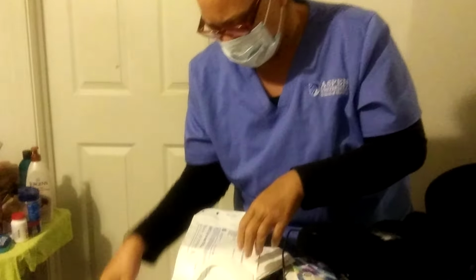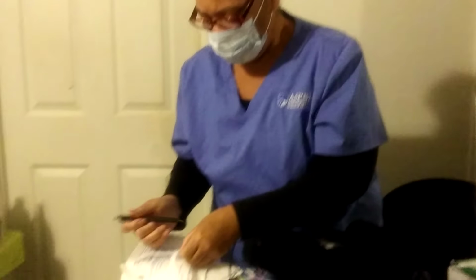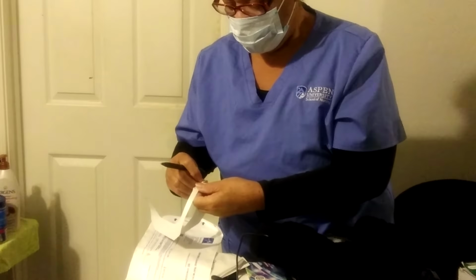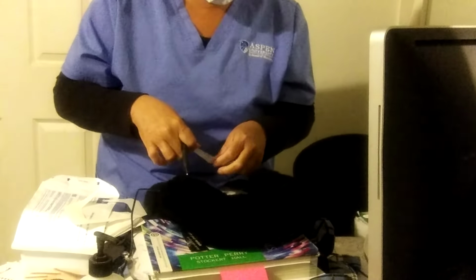And I write down my name, my initials, the date and time I changed the dressing, on a piece of tape, and I apply this piece of tape onto the side of my dressing.